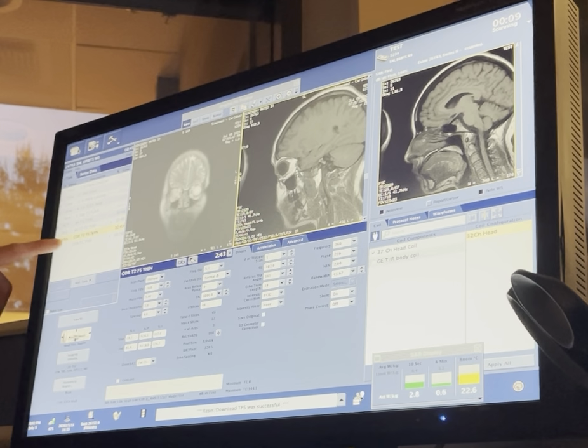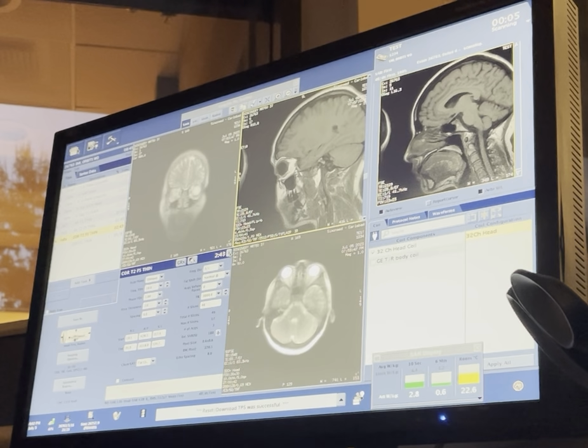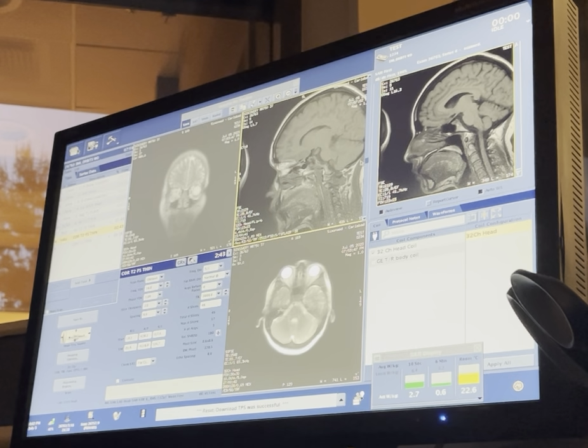So we're in our coronal. And we have, let's go to those slices again. Let's try to find them on the other eye this time, because why not? For this one? Yeah, so let's find them on the bottom eye. Oh, there you go.